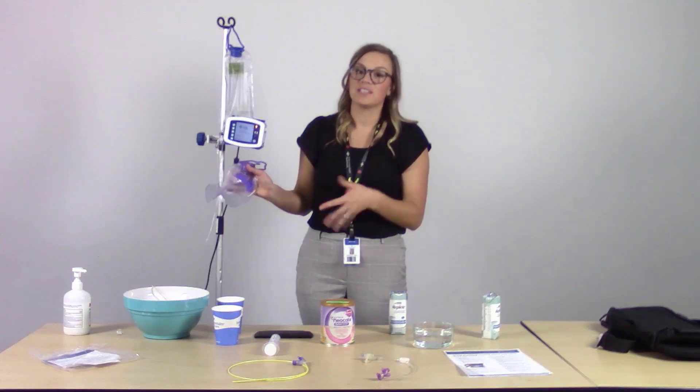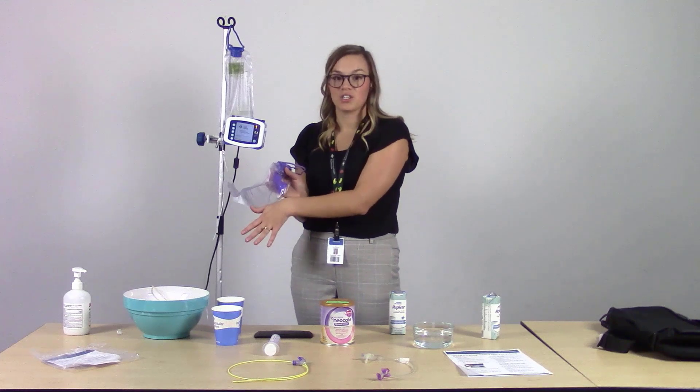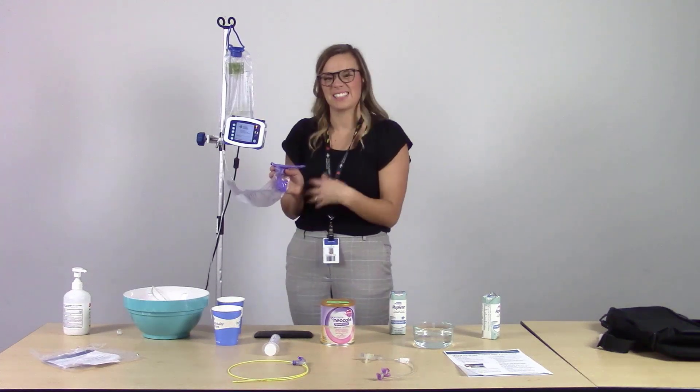If the patient is not able to walk or move to a sink area to rinse the bag out, you can disconnect the patient from the tubing and take the tubing, bag set, IV pole, and pump along with you to a sink area.